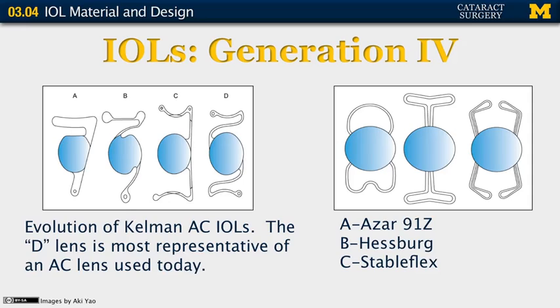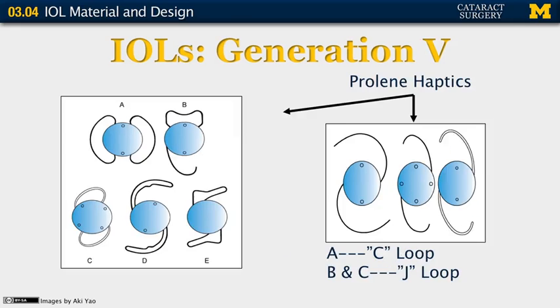Lenses on the right are some of the other versions of anterior chamber lens implants that were briefly in use. These lenses all have closed loop haptics so that the haptic attaches on both ends. These lenses were all associated with corneal endothelial failure and issues with chronic inflammation.